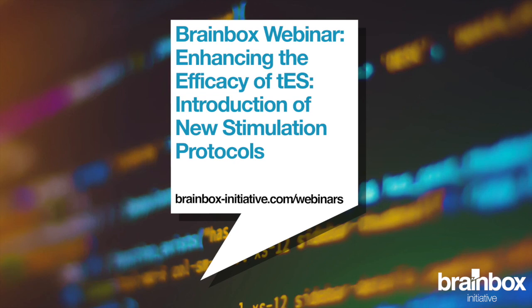There are some studies that showed, for example, 1 milliampere intensity didn't work, but when they increased to 2 milliamperes, they found significant improvement of the symptoms in the case of Parkinson's. But is it the case for depression? We don't know. We should test it.